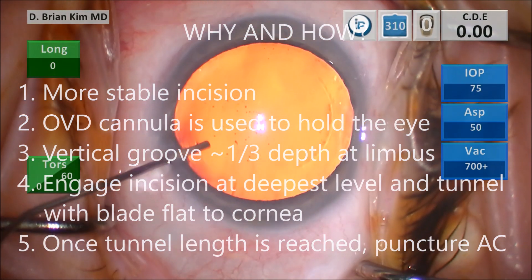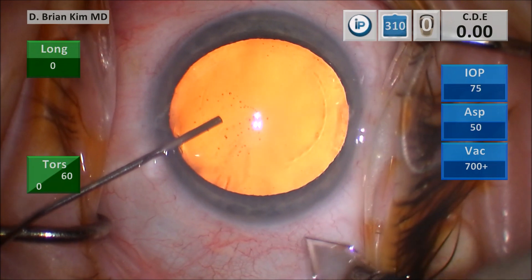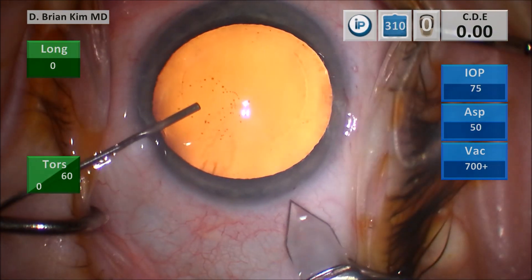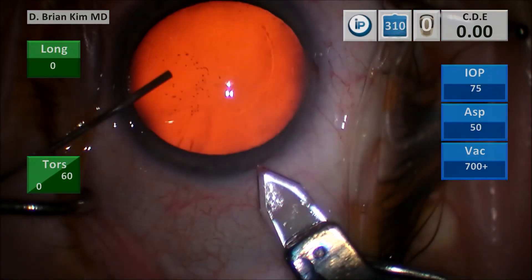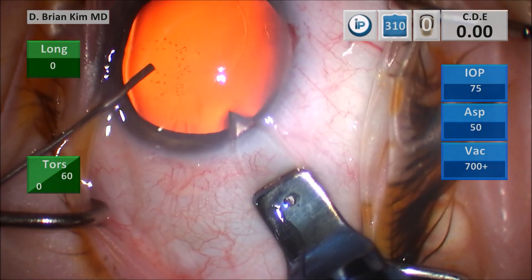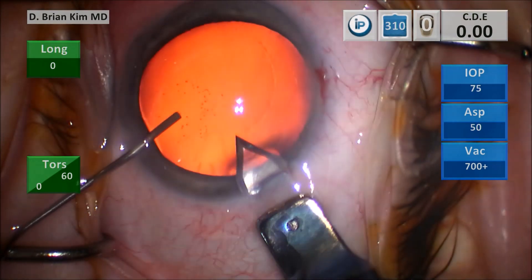As you can see here, I'm filling the eye with viscoelastic and then holding the eye with the cannula. I make my vertical groove and then I'm going to find that incision and get right to the depth of it. Then I'm tunneling flat to the cornea, making sure I'm tunneling where I want to go. And then when I'm ready to puncture, I go ahead and puncture.